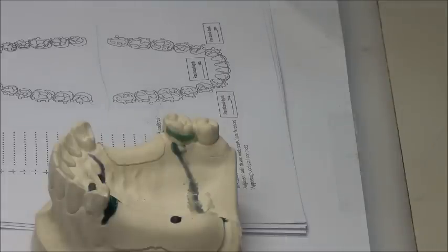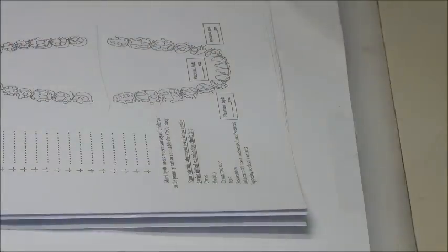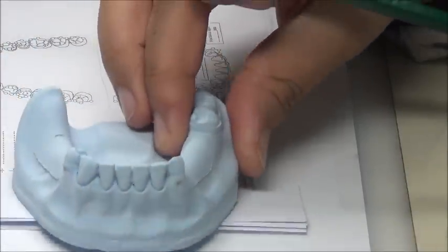Information that will alter my design, and I have to have taken them. I take some information from the survey. What else? What about clinical examination? Occlusal examination. The clinical examination will show me things that I could not see on a solid cast. The cast is solid.